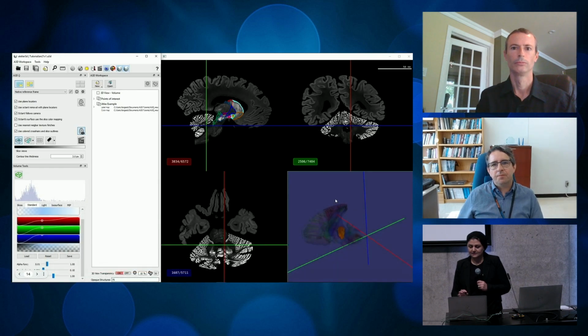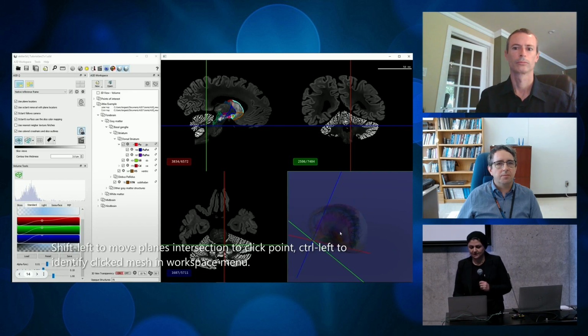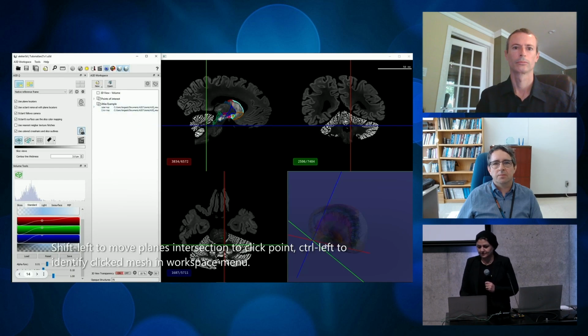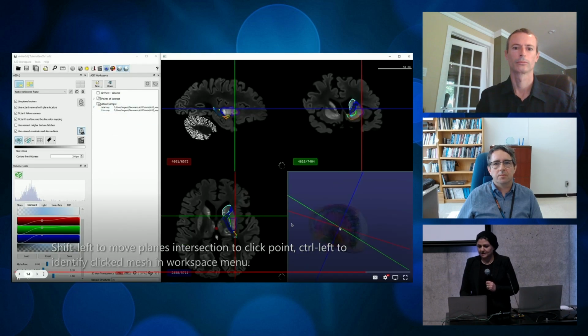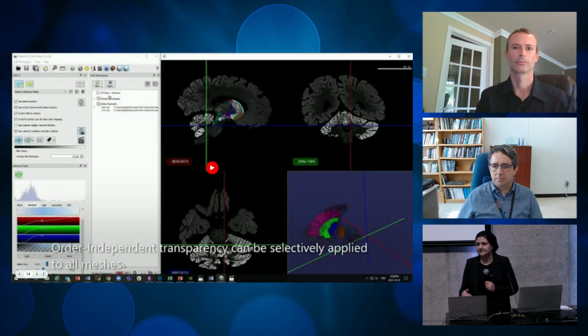You can see lots of surfaces and 3D meshes all together, or you can toggle them to make them visible or invisible. You can press check here to omit the 3D histology to be able to see the surfaces in much more detail.